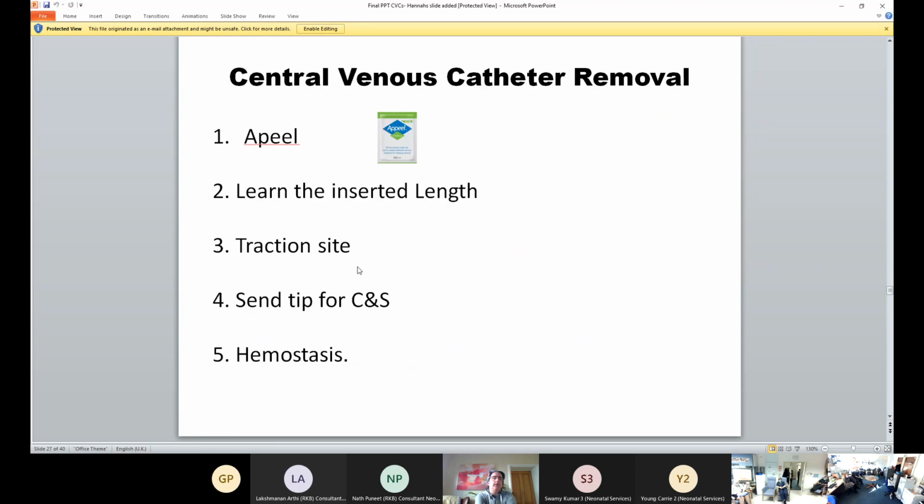Removal of the central venous catheter. That's a smooth process, but it can turn into a big drama, as we mentioned at the beginning. If you lost focus for a second and, for example, you were asked to take the UVC out and leave the UAC, and suddenly snapped the UAC, that might lead to massive bleeding.